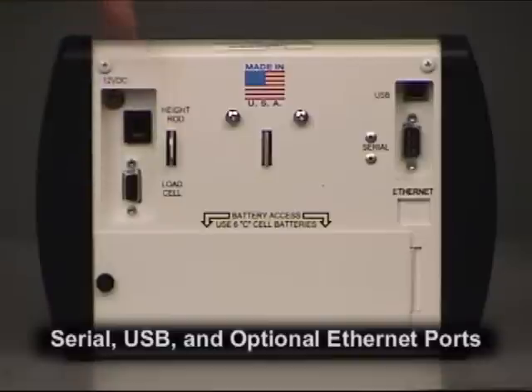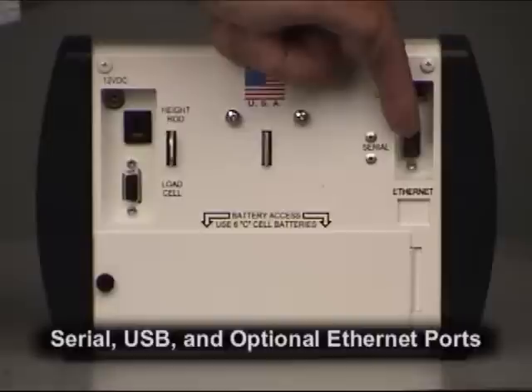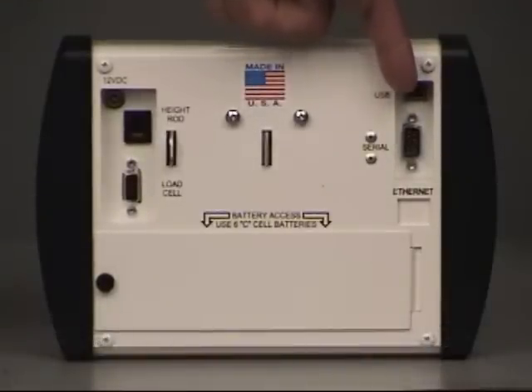Every Detecto model 758C weight display comes with serial and USB ports for connectivity to extended features such as label printing for patient records, handheld scanners for barcode patient ID bracelets, output to the PC for electronic medical records, and even an optional Ethernet connection for sending patient data to a network within EMR applications.